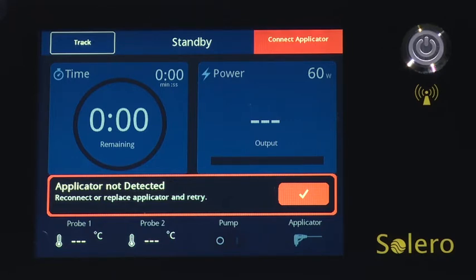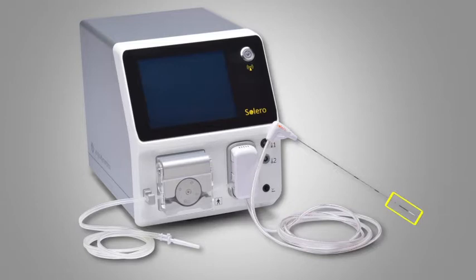Next, the system will prompt the user to connect the applicator in the top right corner of the screen. The applicator includes the applicator tip, applicator shaft, applicator handle, applicator tubing, applicator cartridge, coolant pump tubing, pump clip, and the coolant reservoir spike.